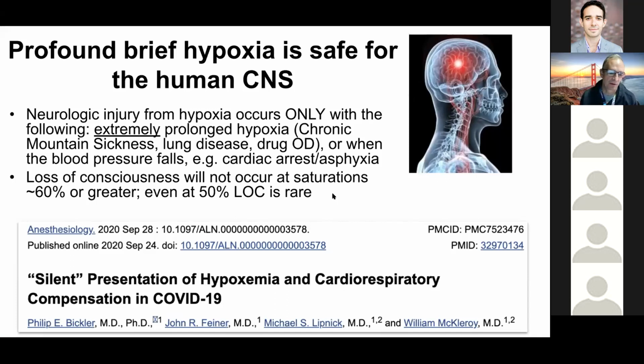I mean, I could spend the entire time just talking about the effects of hypoxia on humans, aside from pulse oximetry. But in our studies thus far, we have enrolled about 7,000 subjects and subjected them to pretty profound hypoxemia.